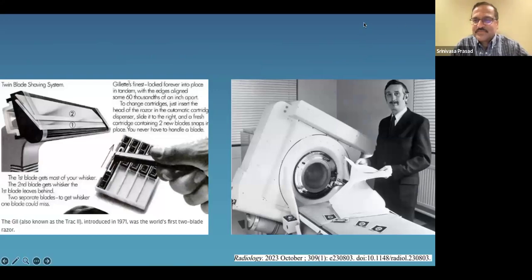As we see here, 1971 was a great year in that the first CT images were generated by Sir Godfrey Hounsfield. It's interesting that it took almost 30 minutes to get one slice of the brain, and almost another 2.5 hours of post-processing. So by the time Dr. Ambrose, the radiologist, saw the images, it was 2 days later.